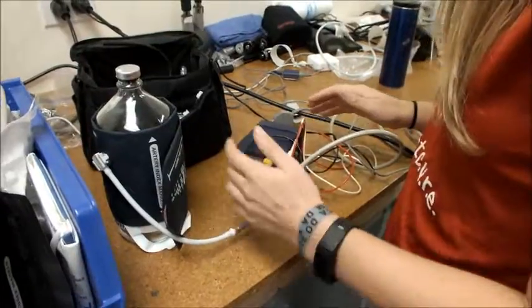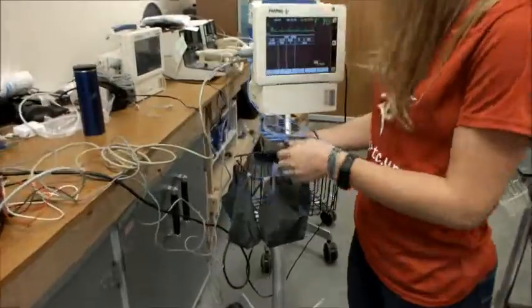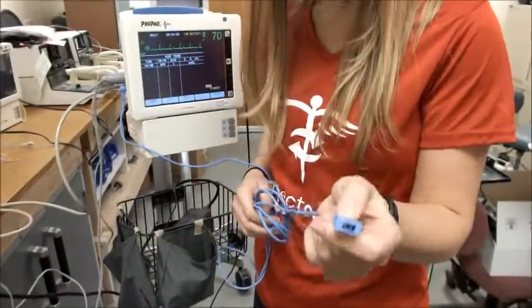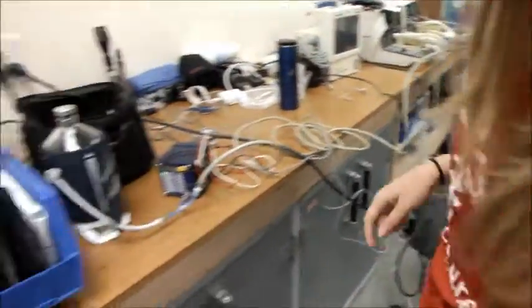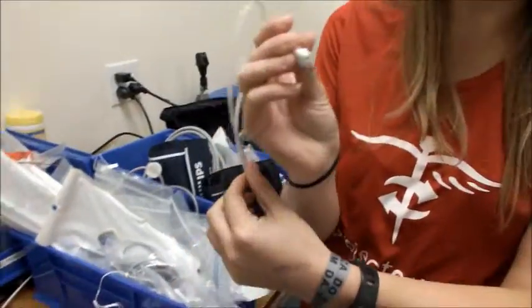The last step in setup is to find the temperature probe, which will connect to the end of the temperature cord you found earlier. This has two prongs in the temperature cord, so we're going to look for a temperature probe that also has a two-prong connection.